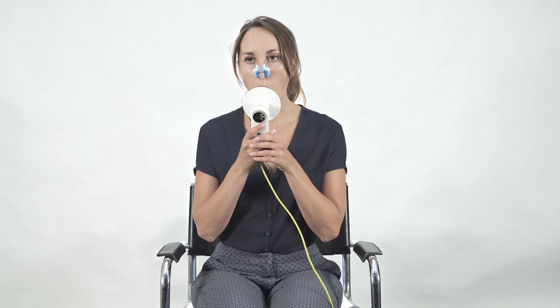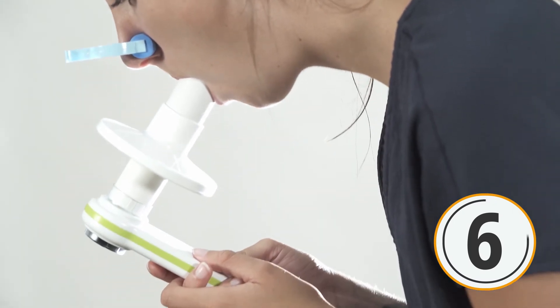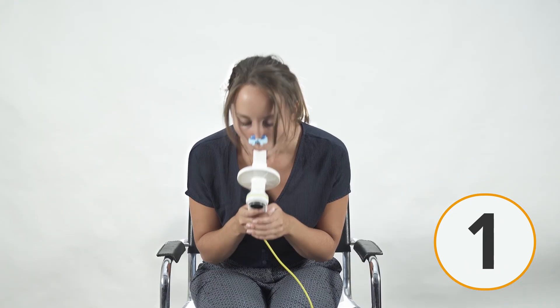Ask the patient to wear the nose clip and place the mouthpiece in the mouth, then start the spirometry test. The patient will take a big, deep breath to fill up the lungs completely, then blow out as hard and as fast as possible for at least six seconds until the lungs are absolutely empty.